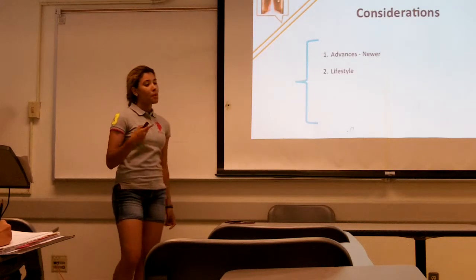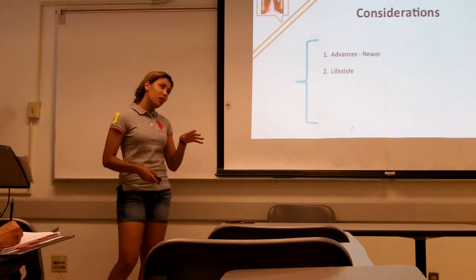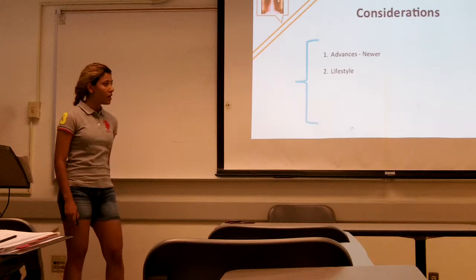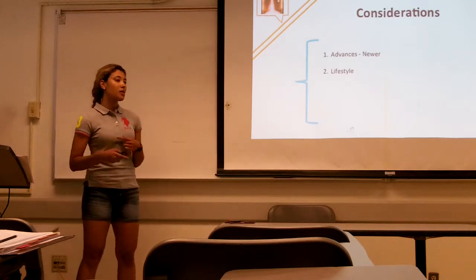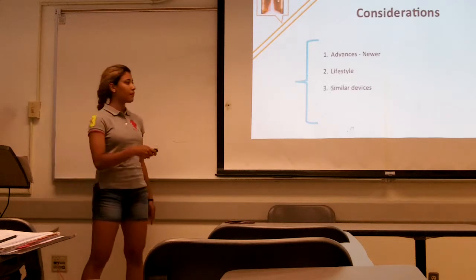He needs to replace the battery in 5 to 15 years. He needs to go to the doctor to replace the battery. He also needs to submit himself to checkups regularly, every 3 months.